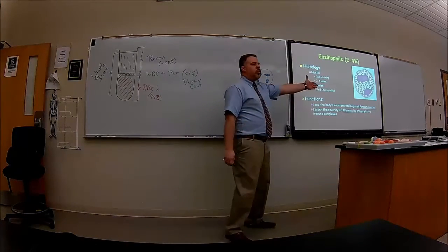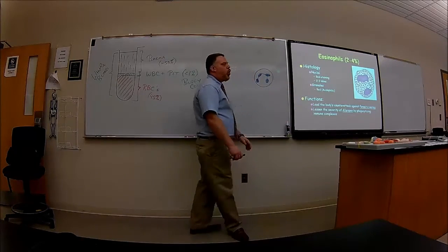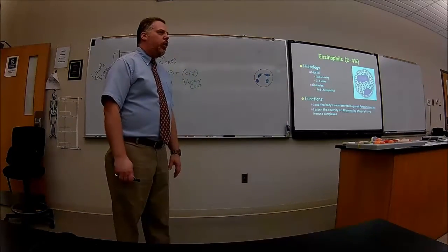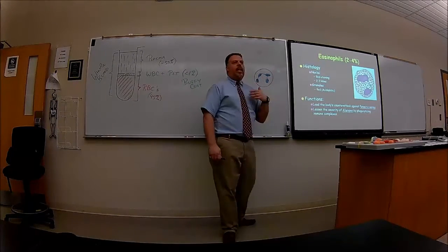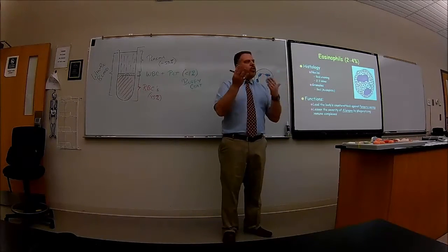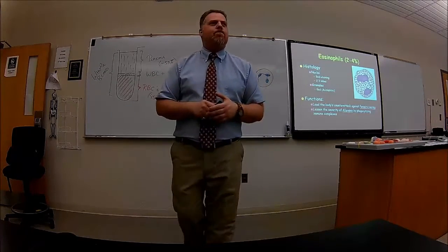Eosinophil. Look, that looks totally different. It's lobed, but usually only 2 to 3 lobes on there. But its granules are red in color. It actually looks like, if you have red blood cells around there, they're staying the same color as the red blood cells. So if you see the red blood cells looking the same color as the granules, then you know what this is. Okay?